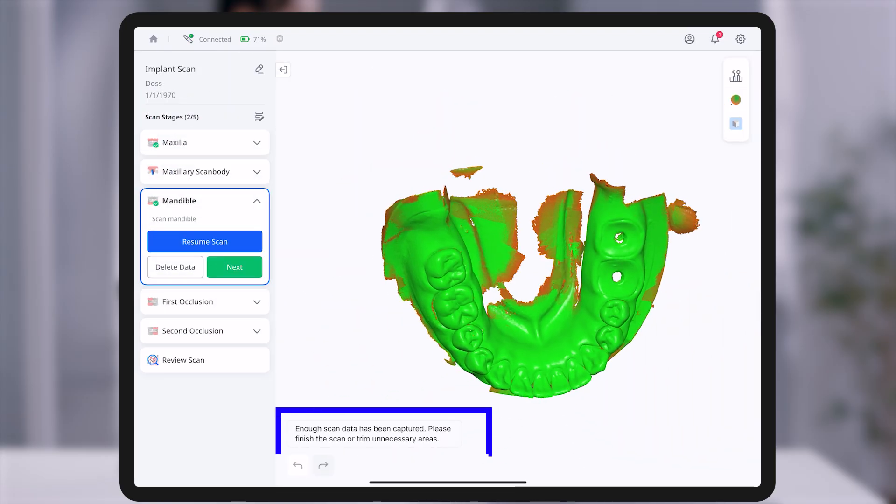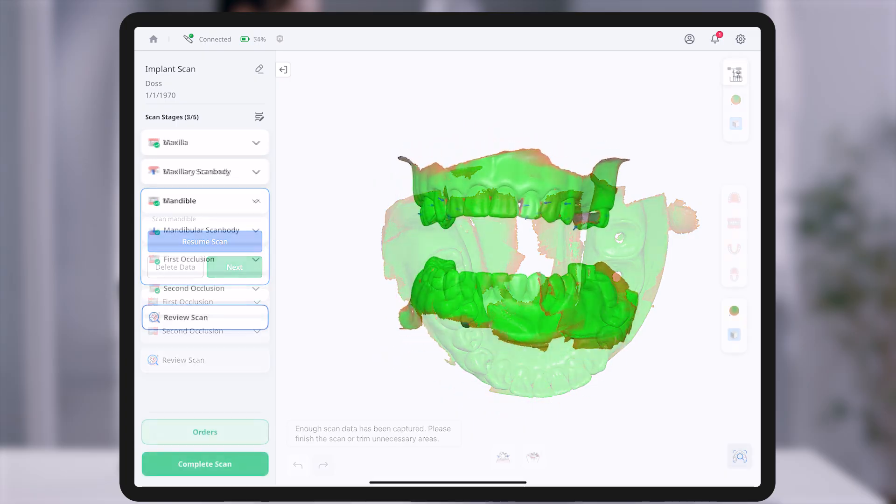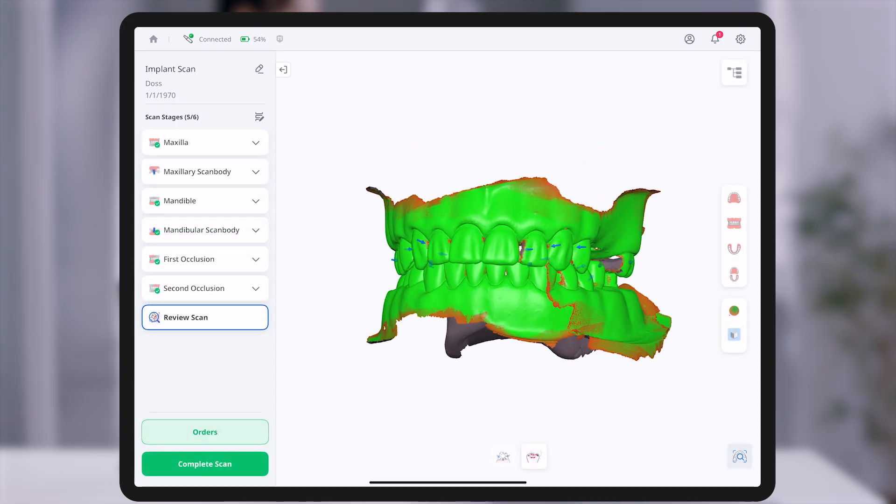If you've already captured the necessary data, you may tap next at any time to continue to the next stage.